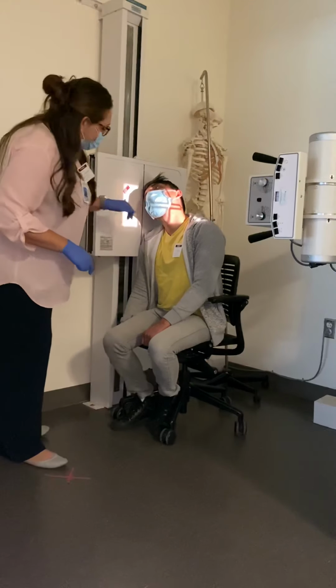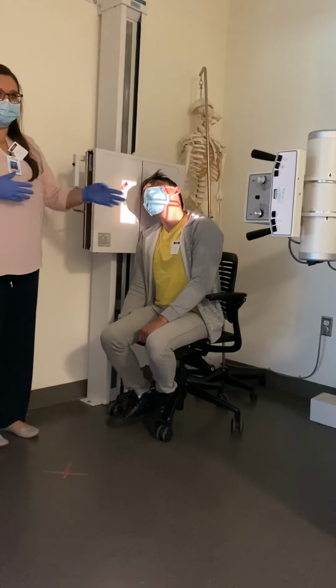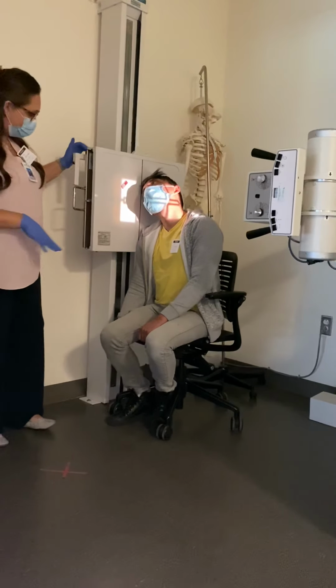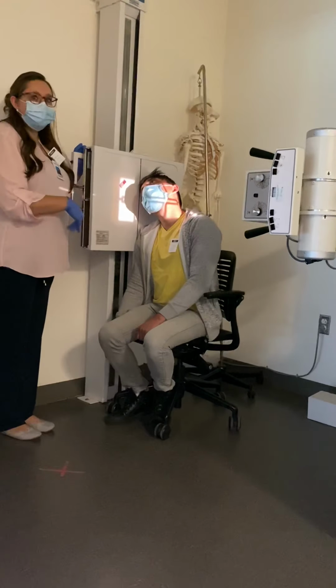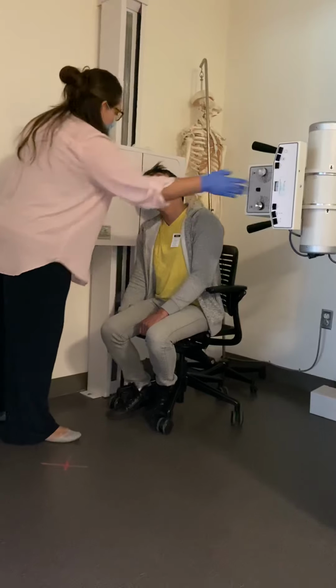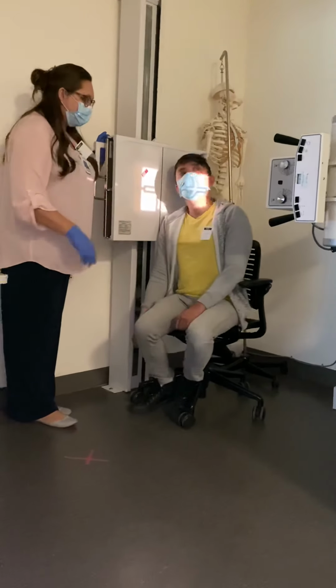So for the axial lateral, we always do both right and left sides. So you do the right and then spin them around and do the left. I'm not going to do that right now. All of the breathing instructions for these are just hold your breath. So don't breathe, don't move. Then I would have him turn and put his back up against here to do the AP.